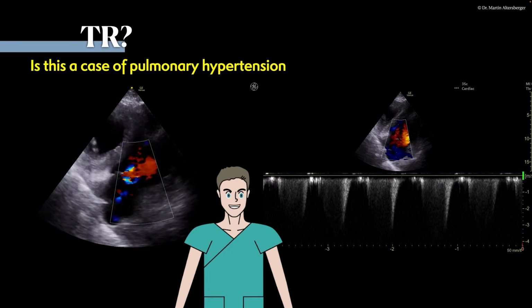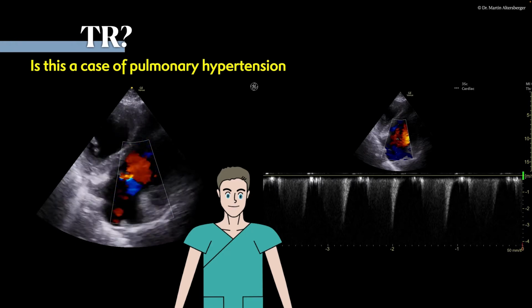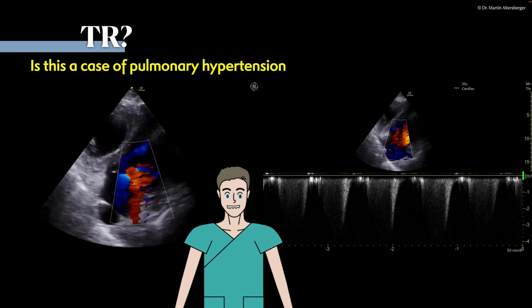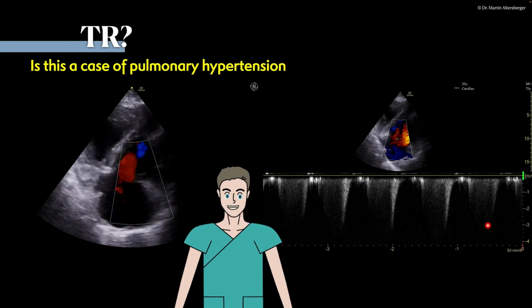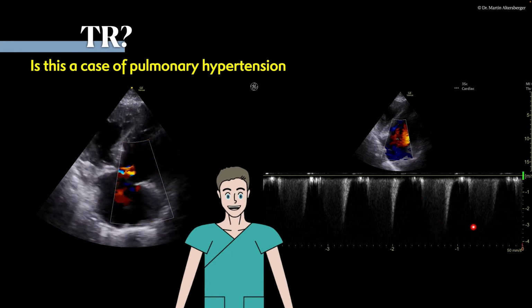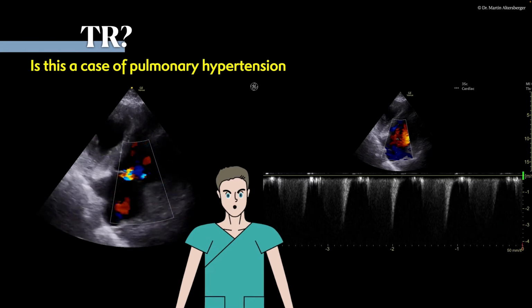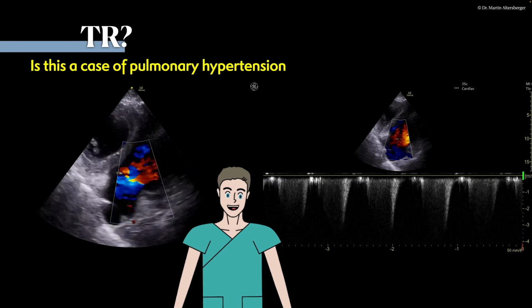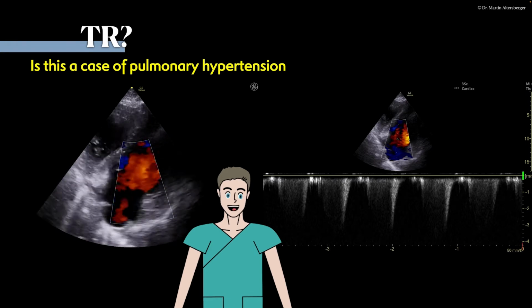Of course, we now have to measure and find the tricuspid valve and tricuspid regurgitation. We already discussed that this might be a case of pulmonary hypertension. If we take a look at the tricuspid regurgitant signal, we see it's not optimal. It's a relatively weak signal, but it's definitely exceeding 3 meters per second. So this is a case where we think pulmonary hypertension is present, and this might be the cause why the right ventricle is dilated, hypertrophied, and impaired in function.